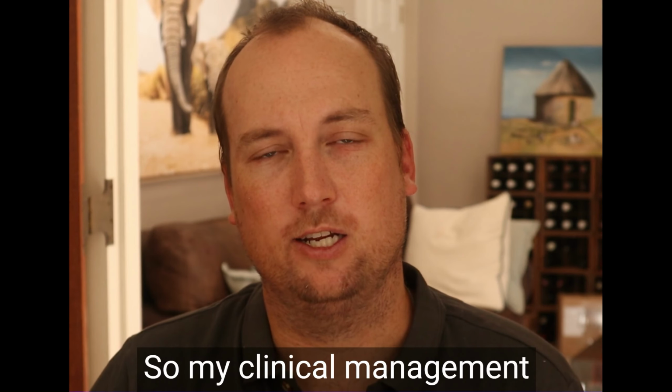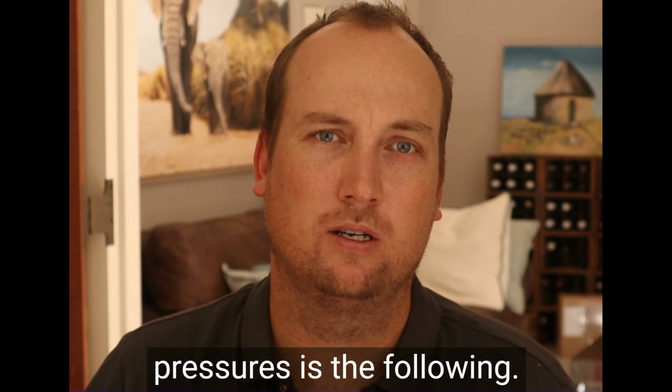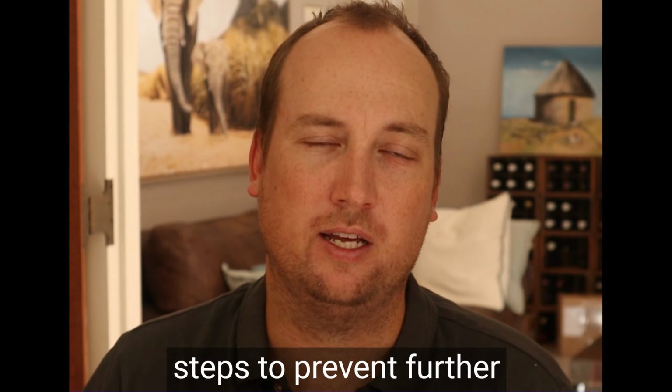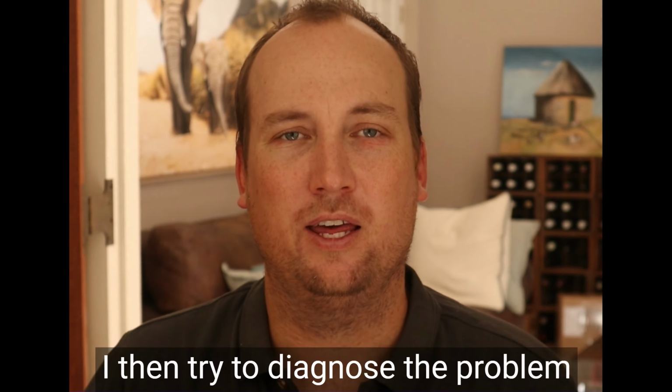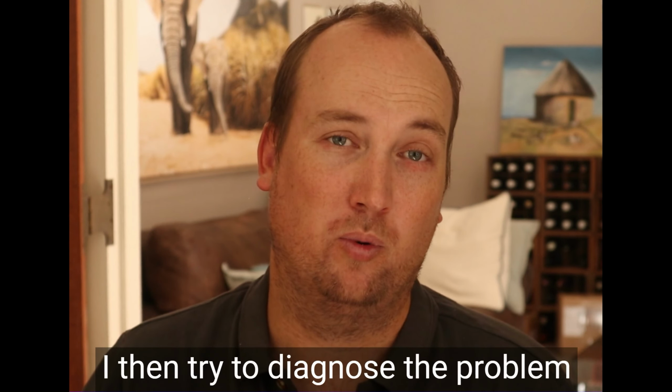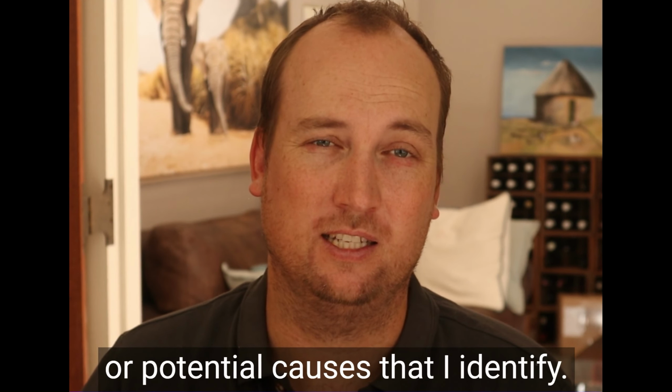So my clinical management of high peak airway pressures is the following. Firstly, I employ safety steps to prevent further deterioration of the patient. I then try to diagnose the problem and I try to correct any problems or potential causes that I identify.